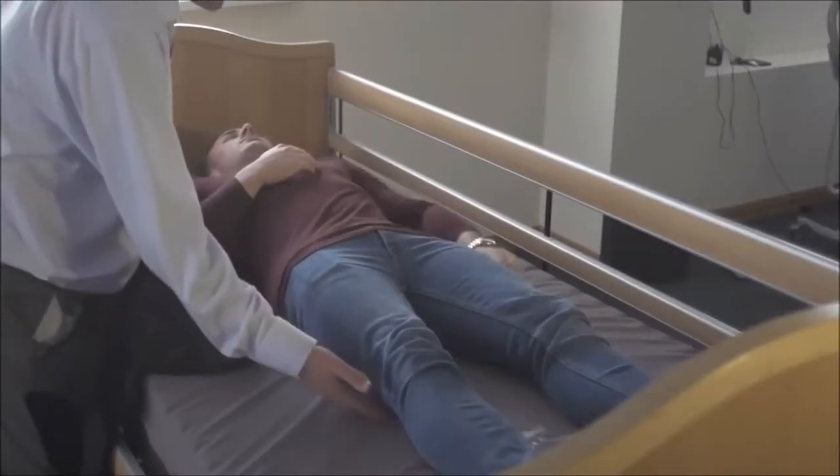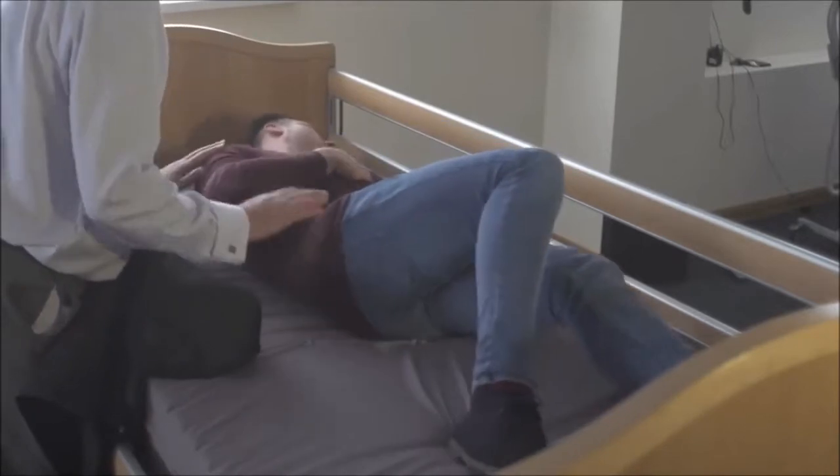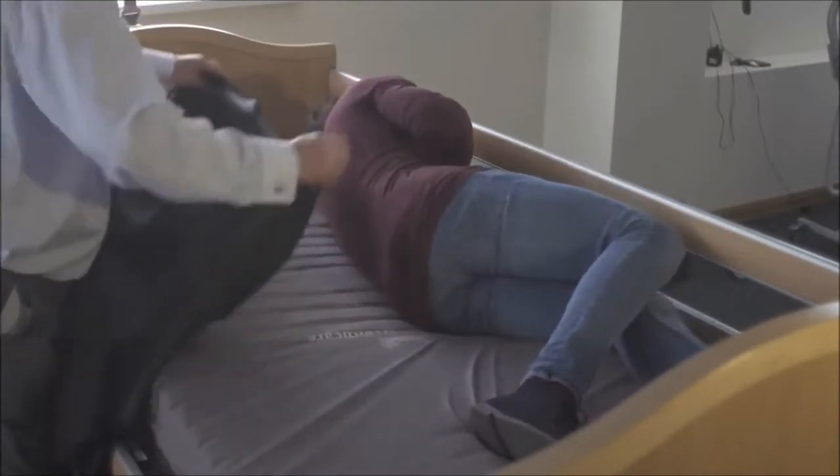Okay Phil, if we could just ask you to roll onto your side, we're going to fit this sling. Raise that knee, arm away and reach over — that's lovely. Perfect.